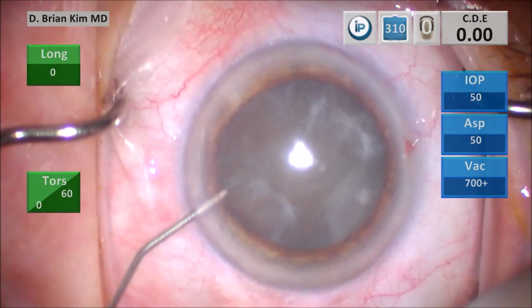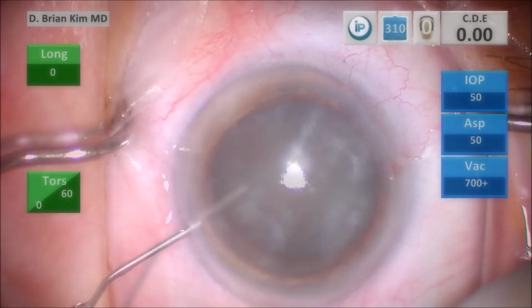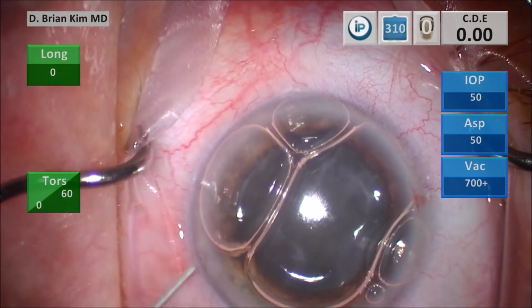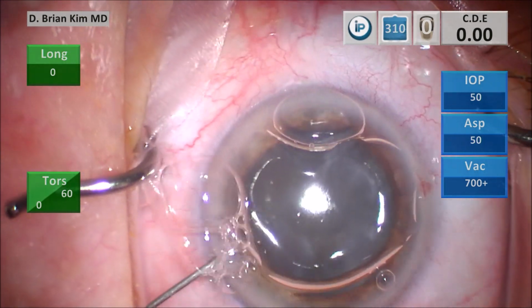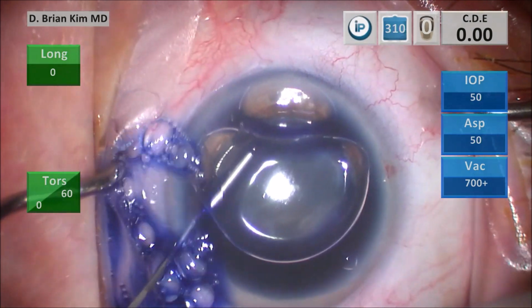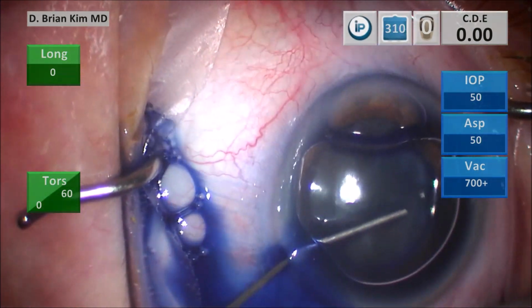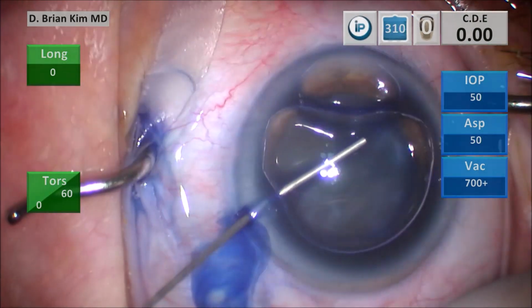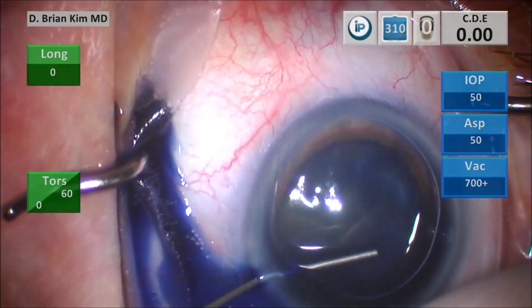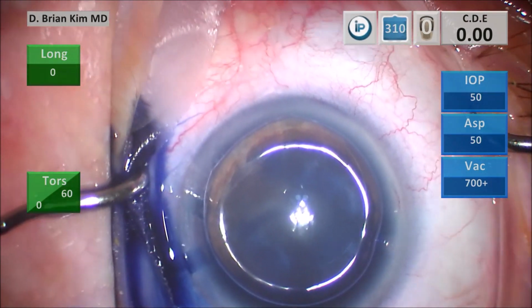I'm injecting some intracameral lidocaine, and then I'm injecting intracameral air. And then I'm going to inject some trypan blue. I like to just paint the surface. Just be very gentle as I paint, and I'm using the cannula as a paint roller, just kind of going around, putting a dollop of trypan on the surface of the anterior capsule.